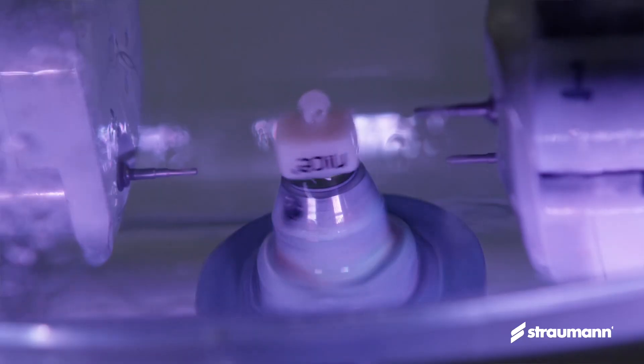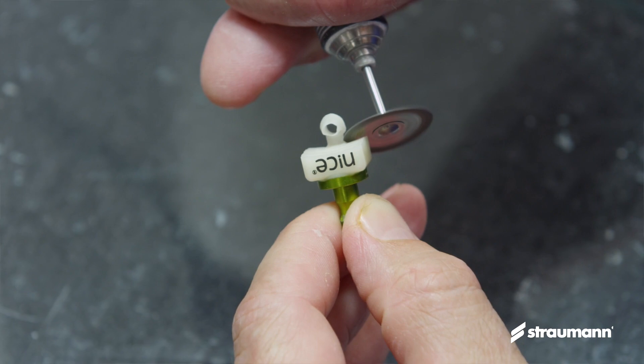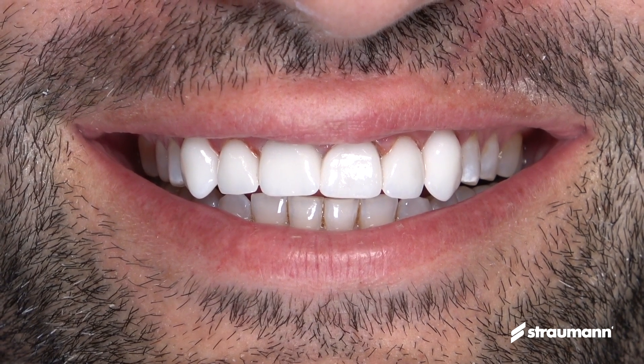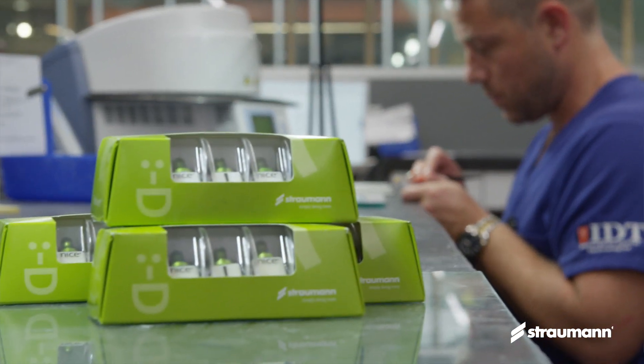For offices that are trying to do same-day restorations, it is extremely beneficial to mill nice because you get the strength without having to spend the time you normally would crystallizing your restoration. They look beautiful, they function very well, they wow our patients — it really is a great mix of strength and aesthetics for the practice.